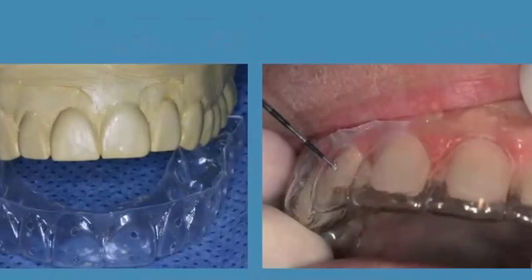You can put an outline over your preparations to visualize that the preps are ideally centered and ideally reduced, so that the lab can do a great job. Now, we know where we're headed with this case. The patient approved the imaging. We waxed the case based on what the imaging shows. And now the dentist needs to prepare the teeth to be able to achieve that.